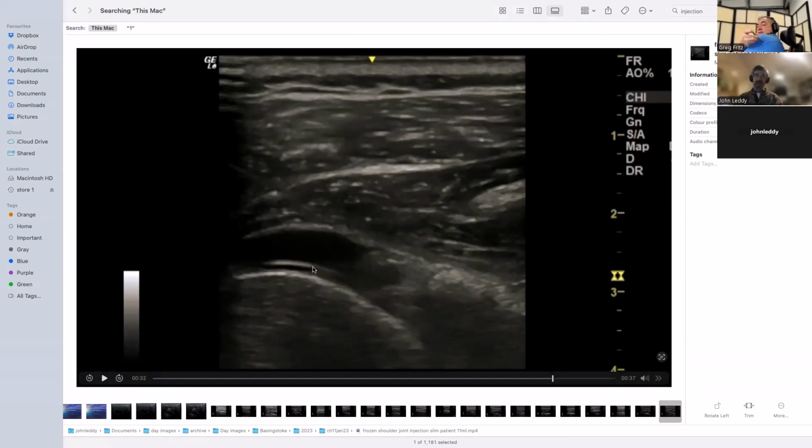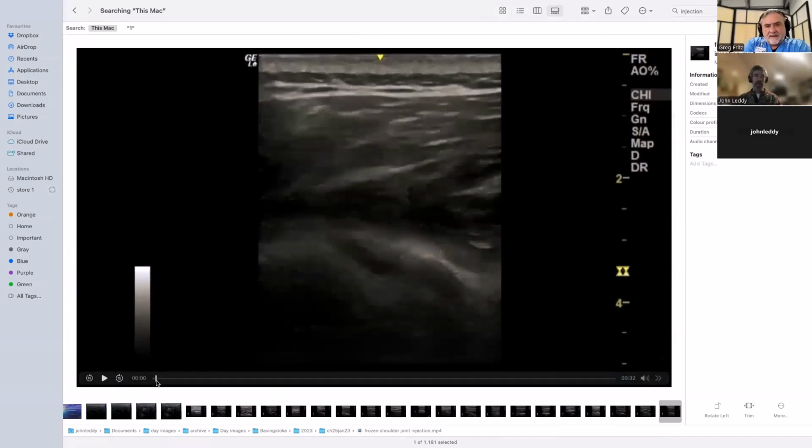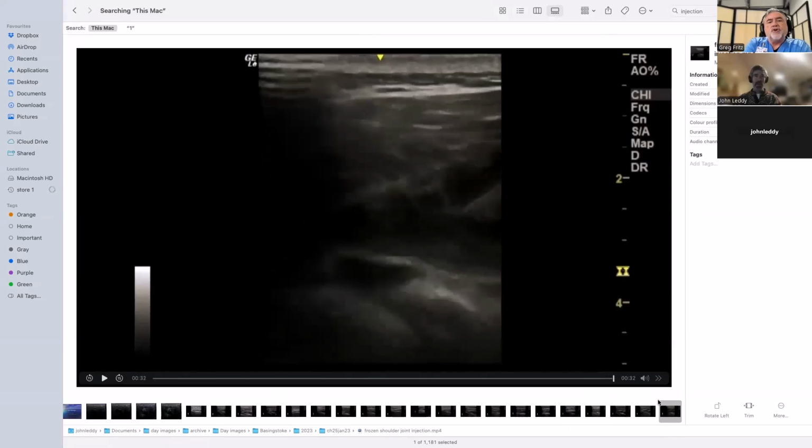I see lots of people doing it the other way, and I cannot possibly imagine why they would do that. They do it the other way. And this way is so simple, so reliable. As you've just seen me show you 10 or 12, the needle just pops straight in. I cannot imagine why anyone would do it the other way. But people reckon the other way is easier, and I'm just not sure how.